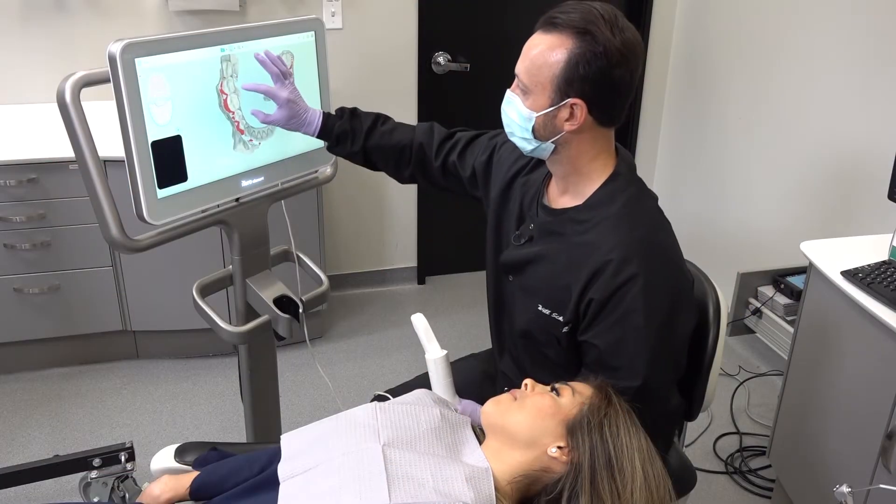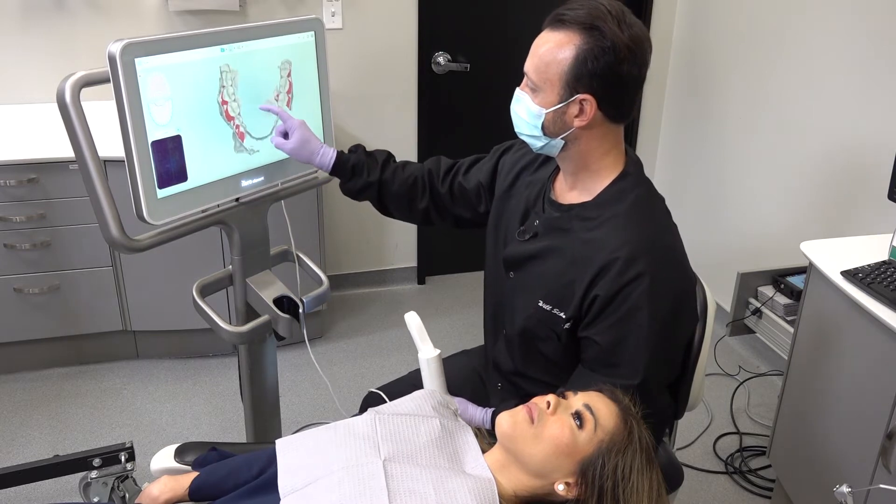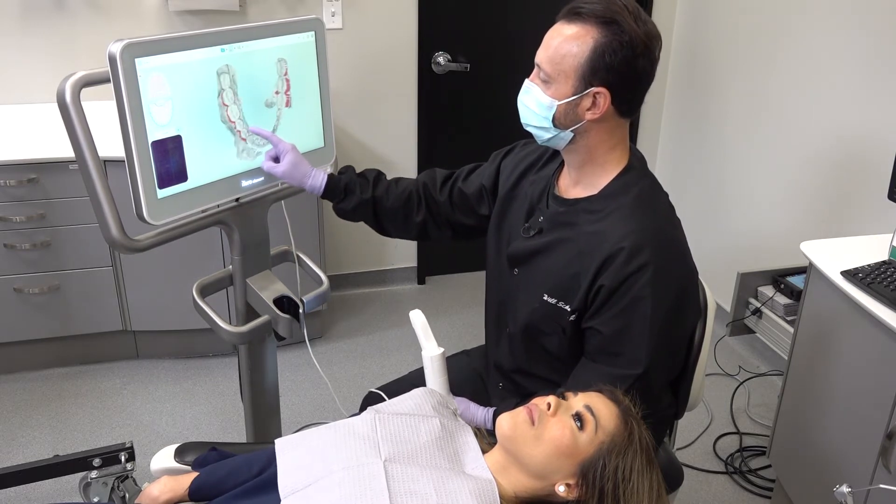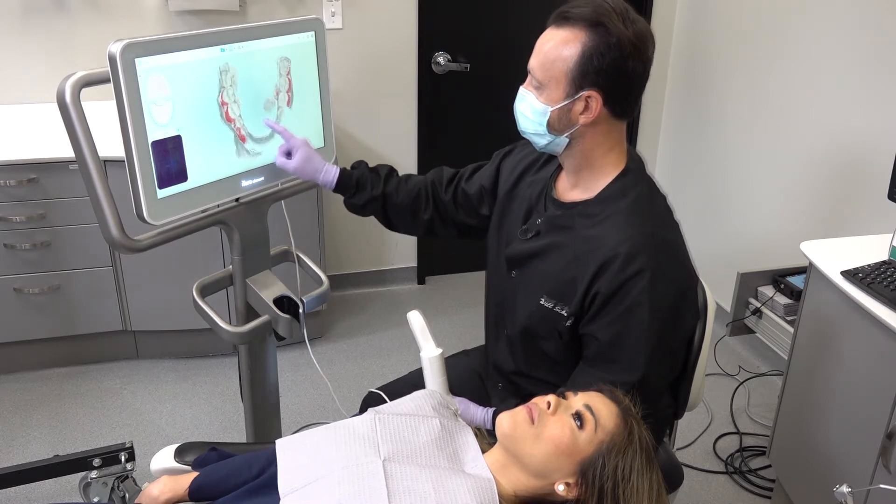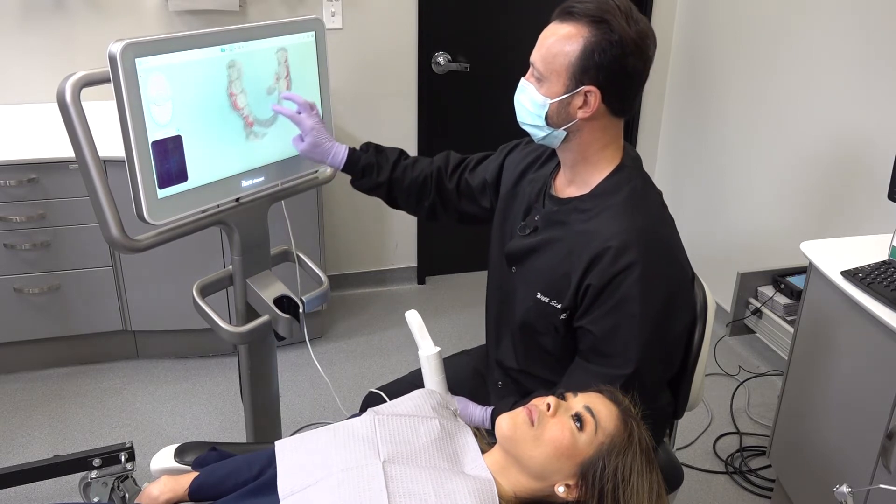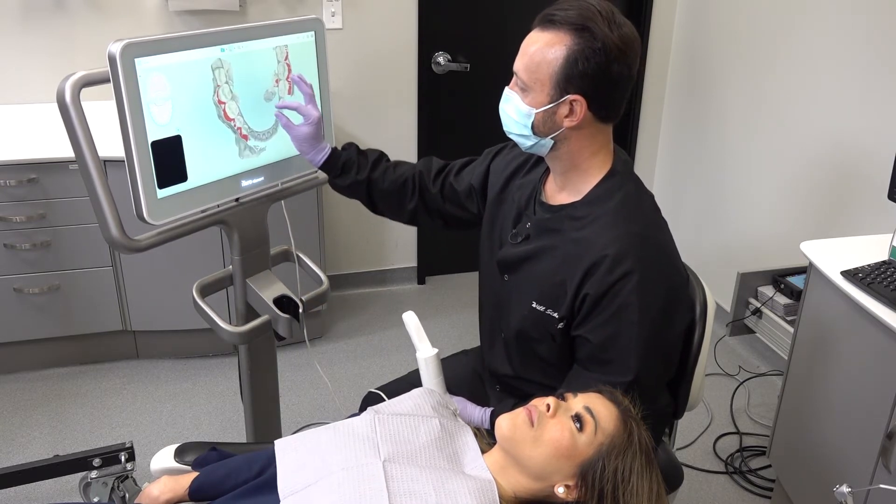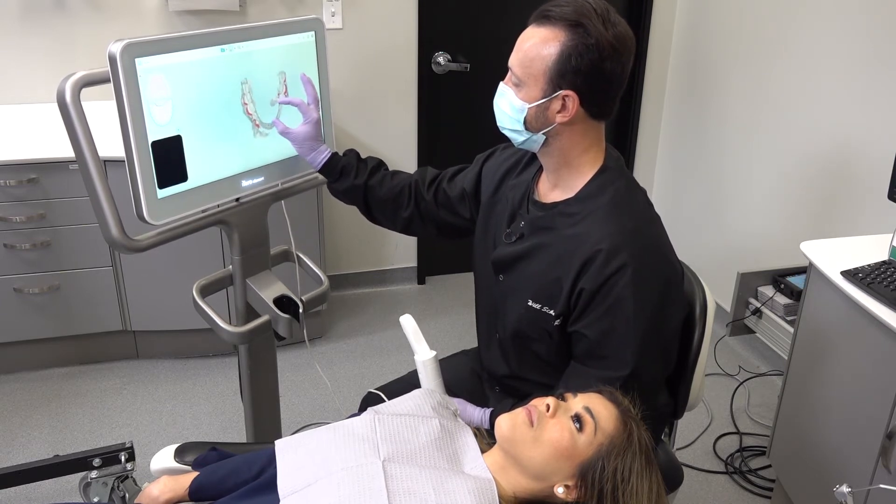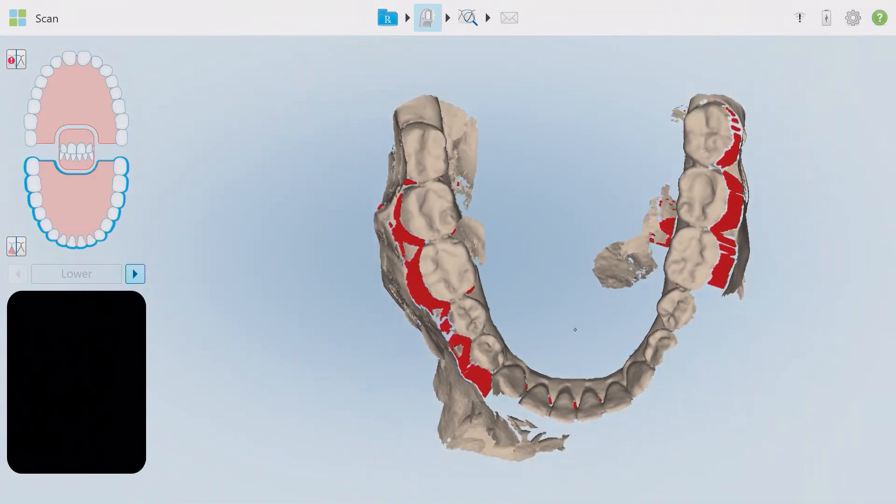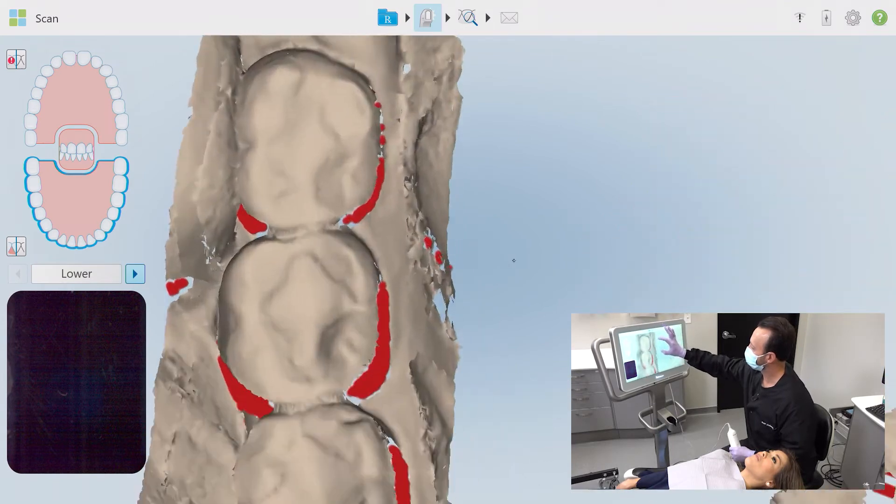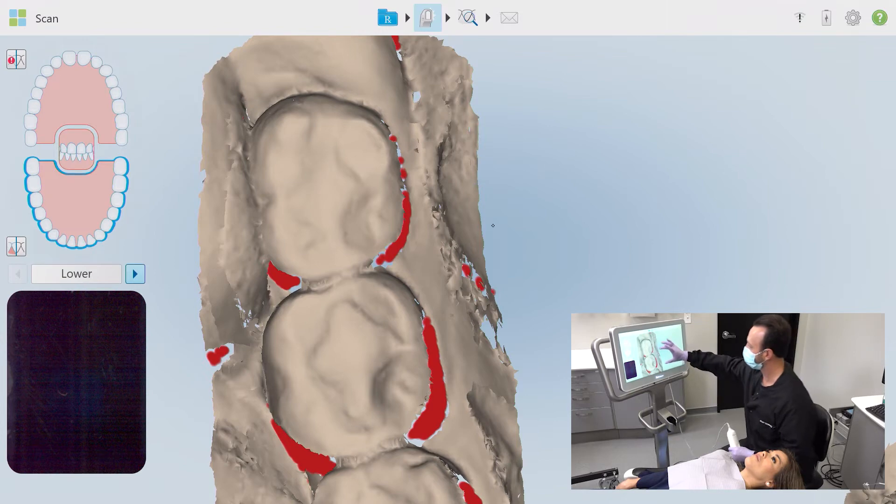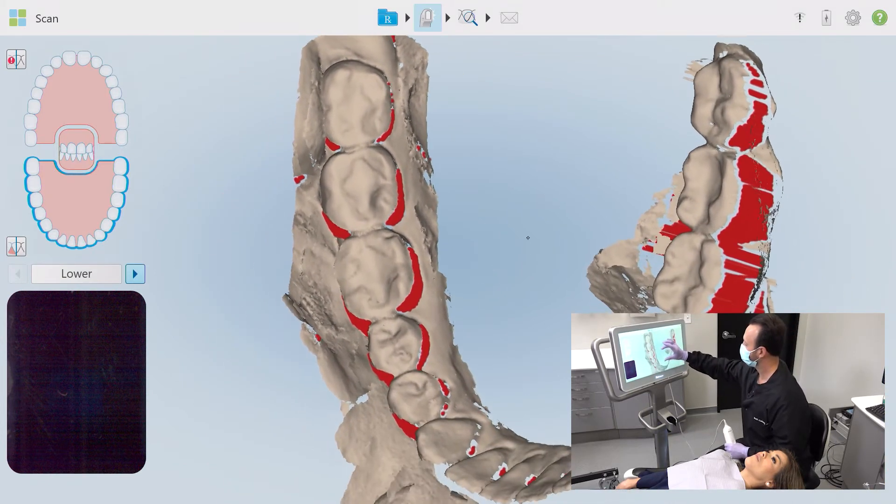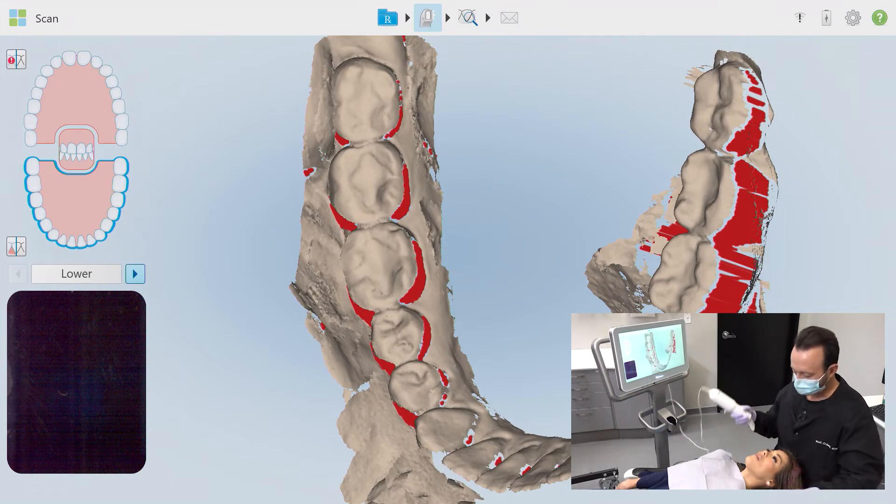I'll tip and turn the scan here to show all of the red areas that have yet to be acquired. When manipulating this scan on screen, there are a couple options you have to view all angles of the scan. Using one finger, moving around on the screen will rotate the scan on its axis without actually moving it around from its centered position. Holding two fingers on the screen will allow the scan to move to a new location. However, the scan is not going to tip and turn. Similar to viewing an image on a touch screen like your smartphone, using two fingers in an opening or pinching motion will cause the scan to enlarge or to minimize. I'm going to zoom in on this portion just for a moment and show the involvement here of the cheek and the tongue in the occlusal scan that we took. I'm not worried about these interferences at all because as we go about our lingual and buccal scans, they're automatically going to be scanned out.